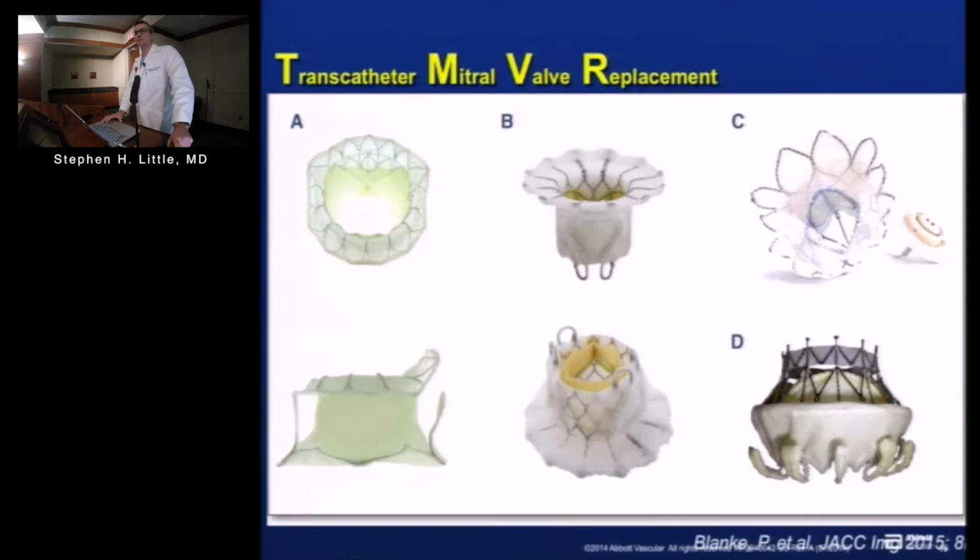Much harder in terms of the technology. Anchoring these devices is much more difficult. A TAVR device is almost universally anchored by just radial force in a calcified root. Anchoring has never really been a problem with TAVR.